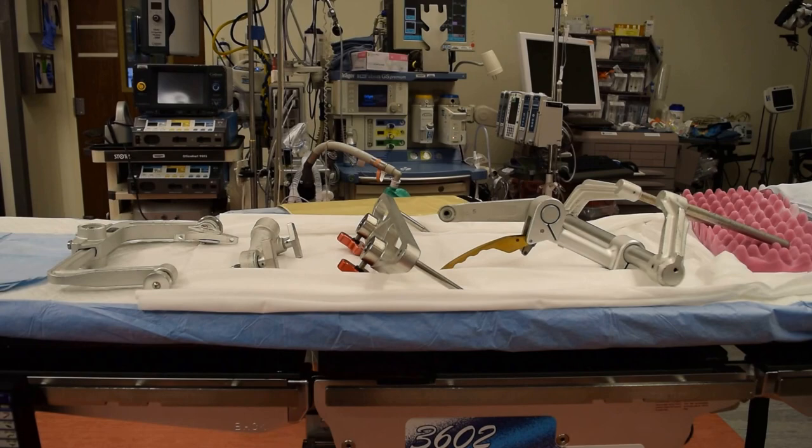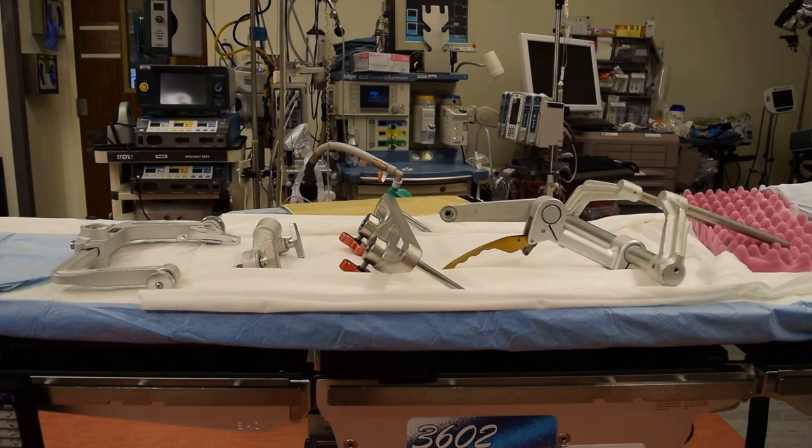This morning we're going to go over how to assemble a Mayfield positioner. A Mayfield positioner is used in neurosurgery to secure the patient's head to the table.